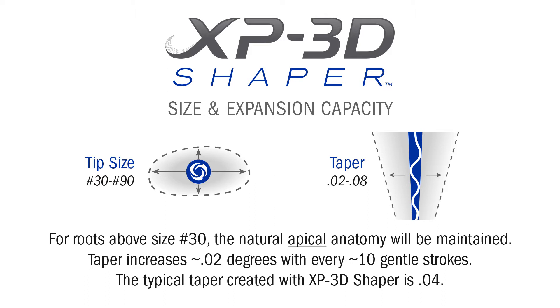For canals naturally larger than a size 30, the Shaper will not expand the apex, but will reach up to and debride all the way up to a size 90 while keeping the natural apex intact.